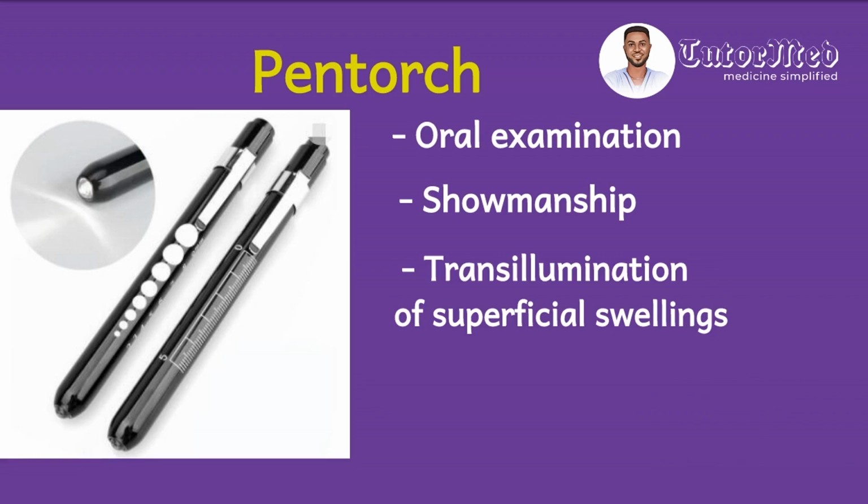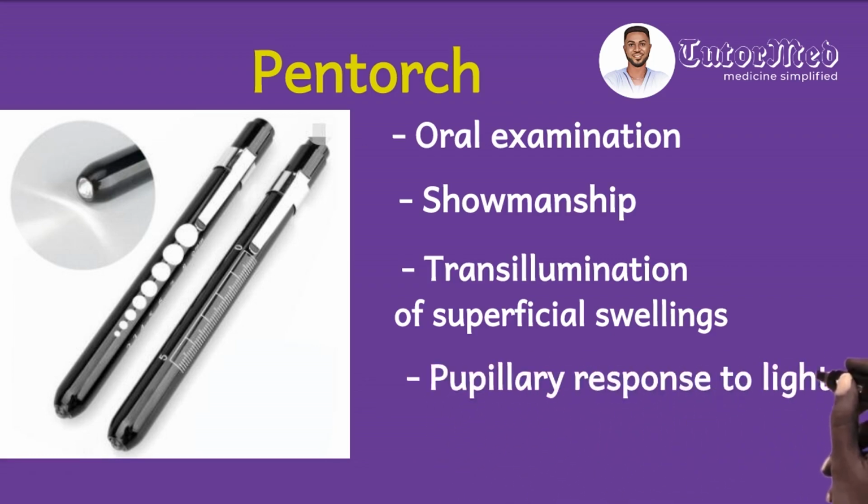And sometimes we use the pen torch to assess the reaction to light by the pupils. It is used to assess pupillary reaction to light, whether it responds to light adequately or not.